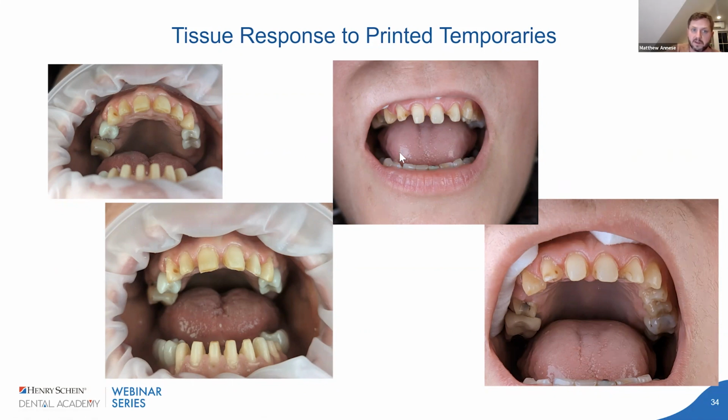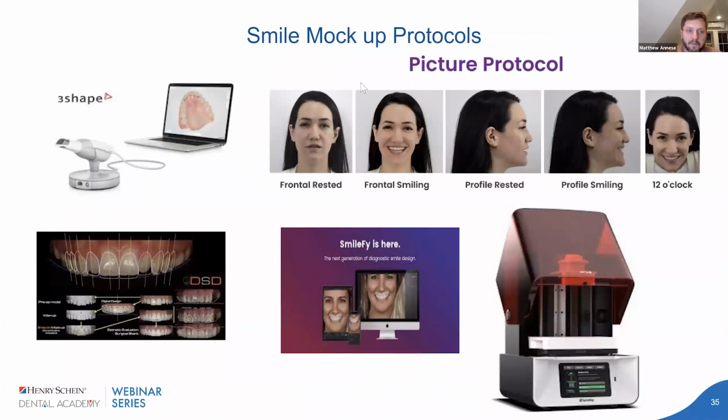So going ready to cement makes life easy. You cement it right away. You don't have to worry about contamination or blood getting underneath your permanent crowns as you cement. So, small mockups, I'm getting a little bit more into these. Again, the cases we featured, I'm still working on, but haven't added the features. And where I think the value is, is if you have those really demanding patients, or patients that have an additive case, that's where this is going to be your wheelhouse.